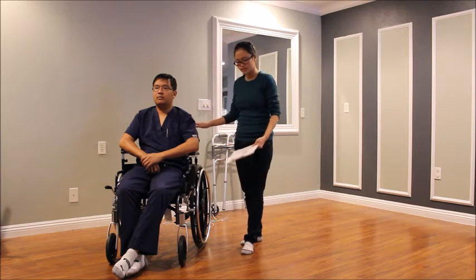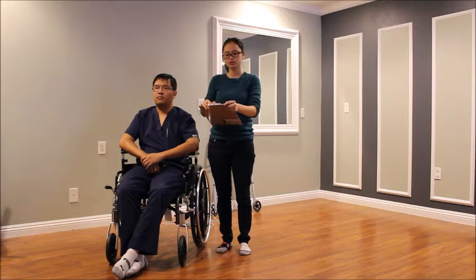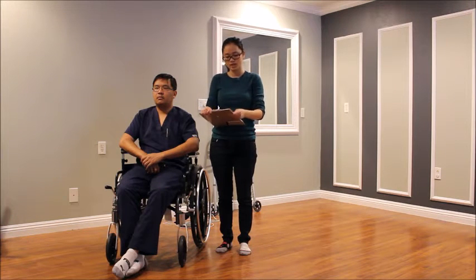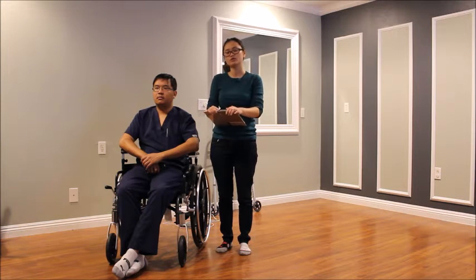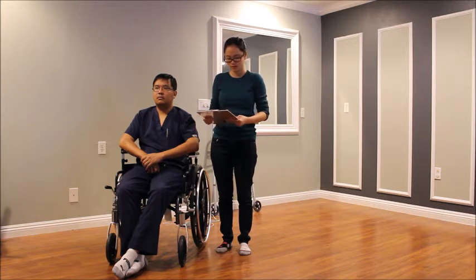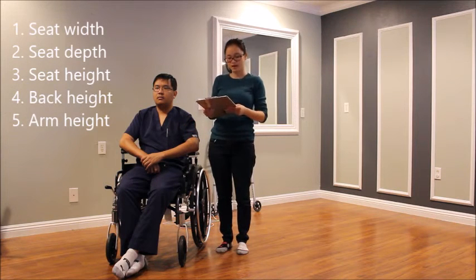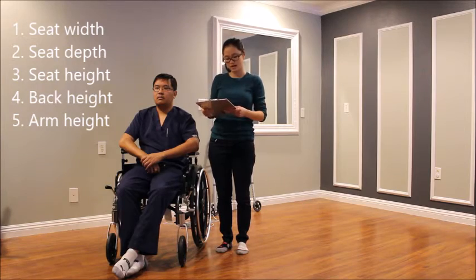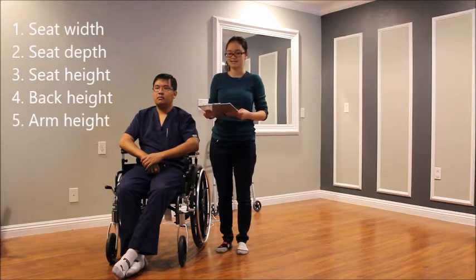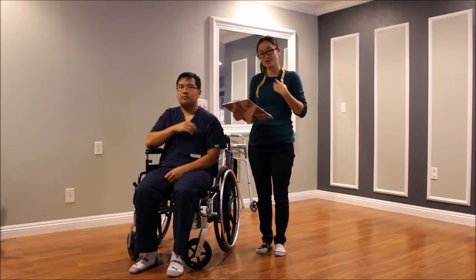What I have here today is a basic manual wheelchair. In order to measure the proper fitting wheelchair, there are 5 categories that we look at. We look at seat width, the seat depth, the seat height, back height, and arm height. So now I'll measure the different wheelchair measurements that we just talked about.